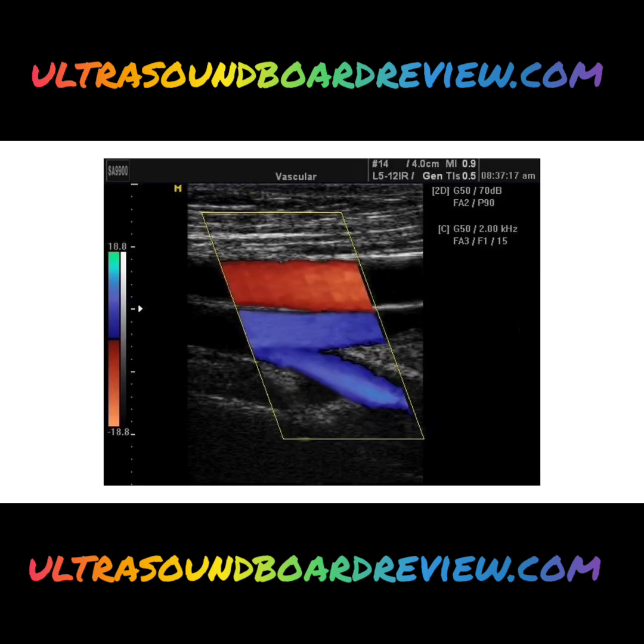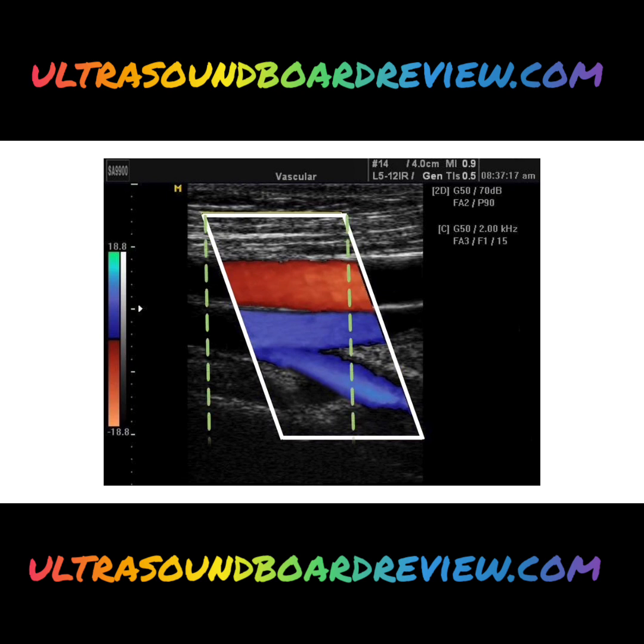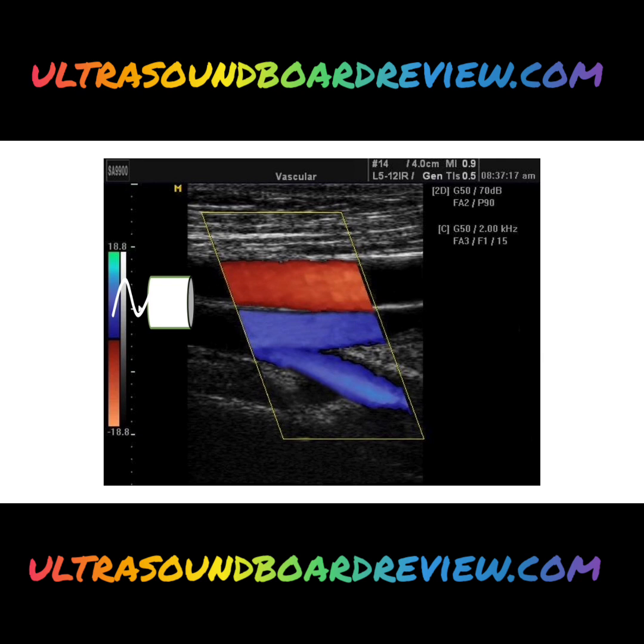Couple different vessels. Here's our color box. Let's locate the two top corners and draw our line straight down. Which line is falling outside of the color box? There we have it. That's the side that our transducer's on. So let's do this top vessel first. This one is red, and red is on the bottom of our color bar over here. We know that if it's on the bottom, it means it's going away from our transducer. There we go. Let's do this bottom vessel. It's blue. Blue is on the top of our color bar. Top means towards, so this flow is going towards the transducer.